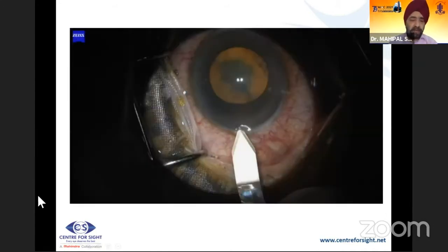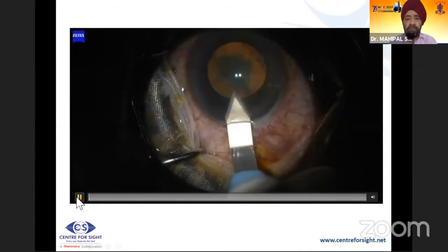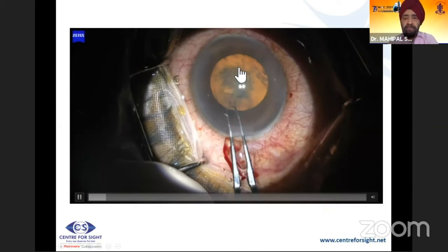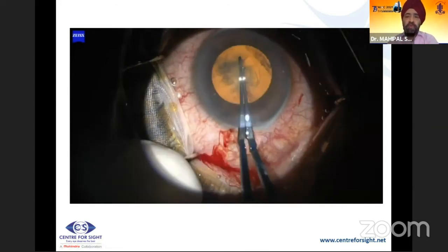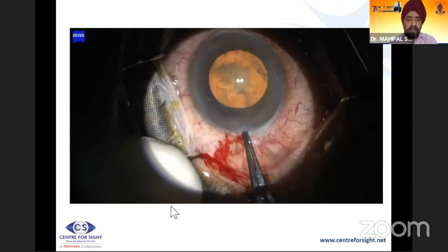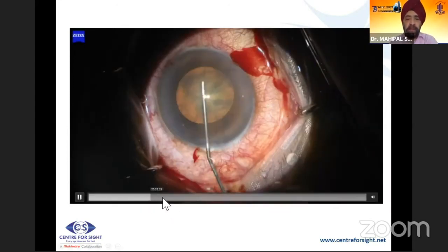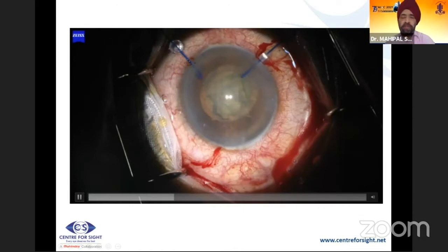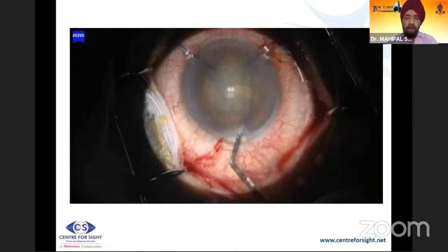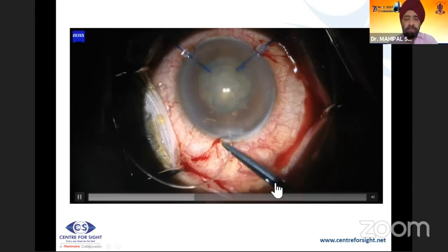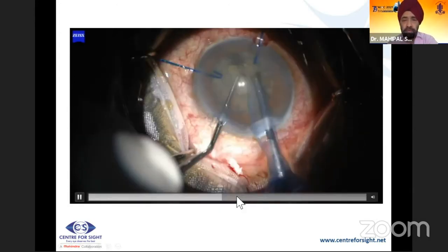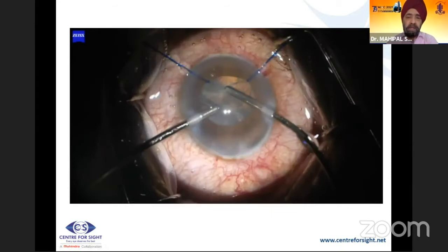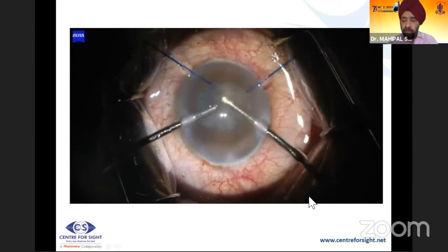In another case without femto, you can see the capsule getting stretched during manual capsulotomy due to lens mobility — this will not happen with femto. You can use two microforceps for capsulotomy. After hydrodissection, iris hooks are placed to hold the capsule. Capsular hooks are better but iris hooks work as well. After placing the hooks plus endocapsular ring, with a softish cataract there is no real problem going ahead. Hooks and endocapsular ring supplement each other for good outcome.